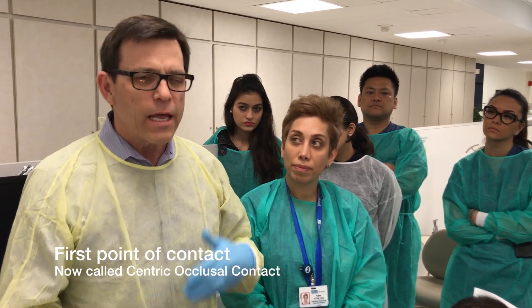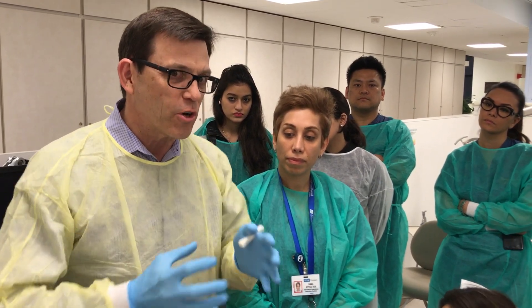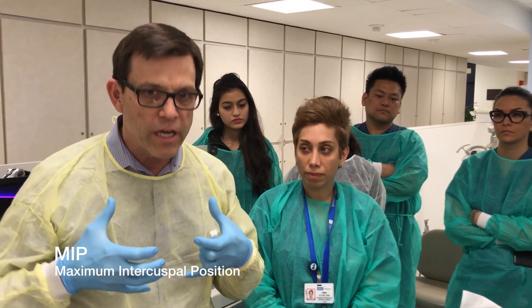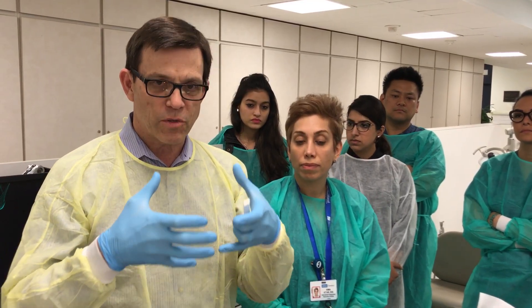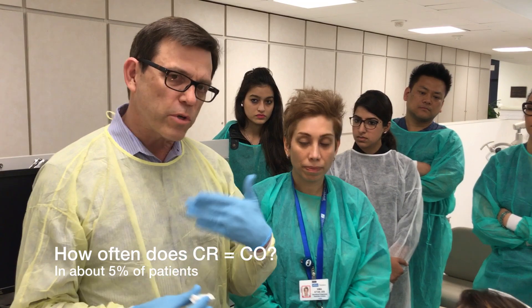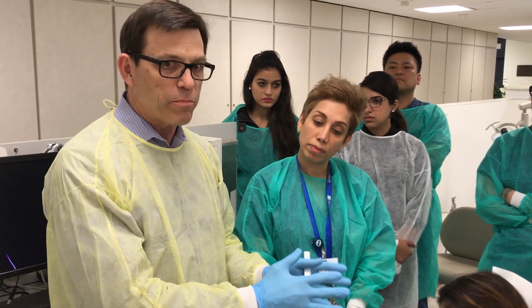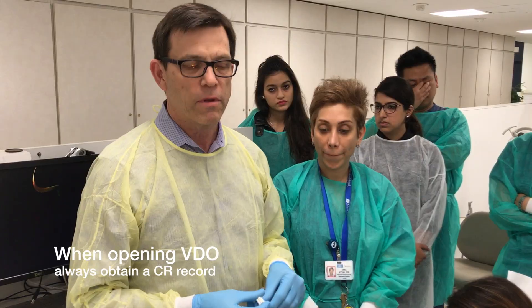We used to talk about CR and CO. Now those terms have all been rearranged and redesigned. The term CO really isn't used anymore for centric occlusion and having all your teeth come together — that's MIP. The term centric occlusion refers to that first point of contact when the condyles are in their centric relation position and we are hinging into a closure pattern. Is it possible to have your CR position come into a CO and the CO position be the same as MIP? Yes, of course. That happens rarely naturally — probably about 5% of the time. But when we're doing full mouth rehabilitations or any time we're going to open up our vertical dimension, we're definitely going to want to operate from a centric relation starting point.